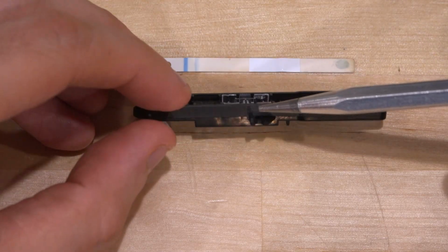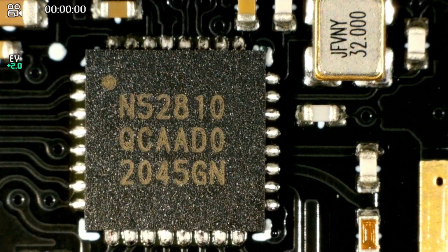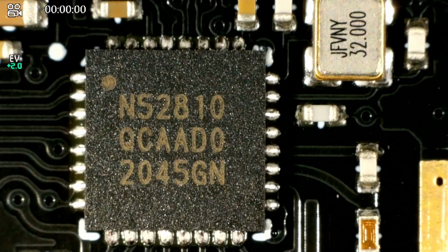Nonetheless, I think we should look at these things a little bit more under the microscope and identify some of these components that are in here, especially this chip. So let's see what we have here. At the heart of it, there is a Nordic nRF52810. This is a fairly complex SoC. It has Bluetooth Low Energy in it. It has a 32-bit Cortex processor in it that runs at 64 megahertz. It probably explains the 32 megahertz crystal we see here. ADCs and IO controls and so many other things are on here. It's a bit of an overkill, I think.